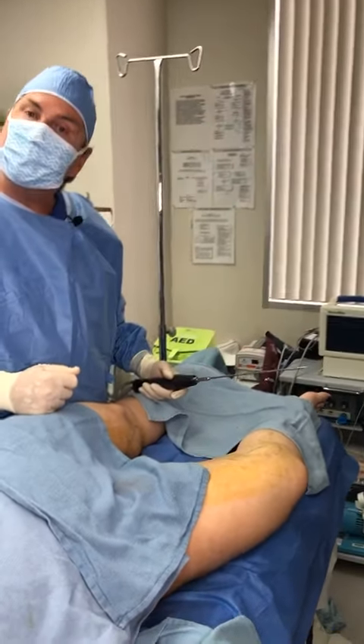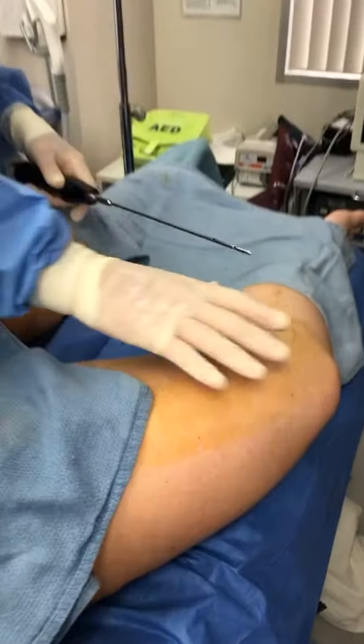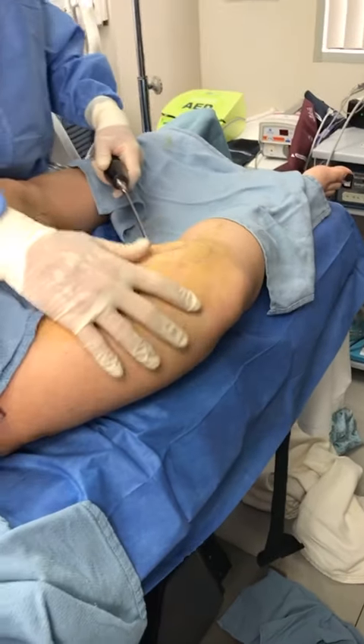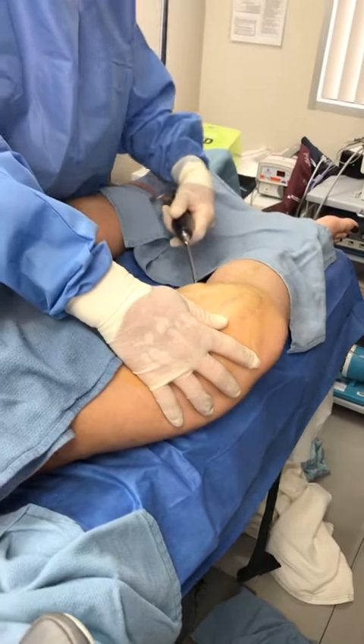We're finishing her inner knees now. A lot of young ladies are really concerned about their knees, and what I do is I numb the area and then I go in with my tickle lipo, just like this.